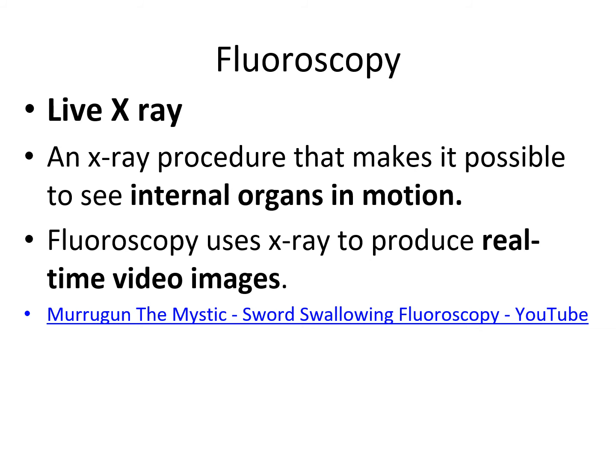They'll also use it in the cath lab. They're doing it the whole entire procedure at the cath lab to make sure they're visualizing basically the coronary arteries. So when they put a stent in or when they put the dye in, they're able to turn it on. It's generally with a foot pedal. The doctor will hit it when he wants to be able to see the image.